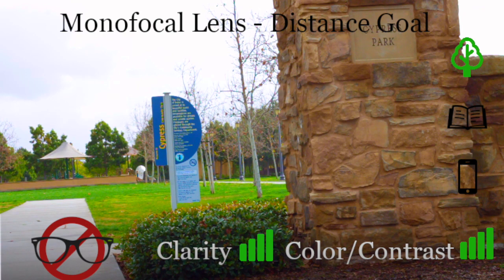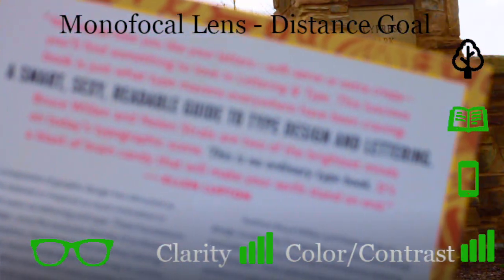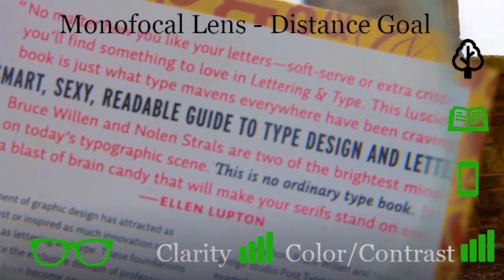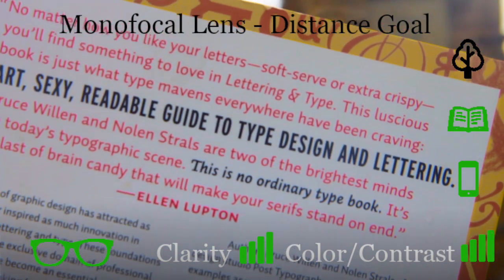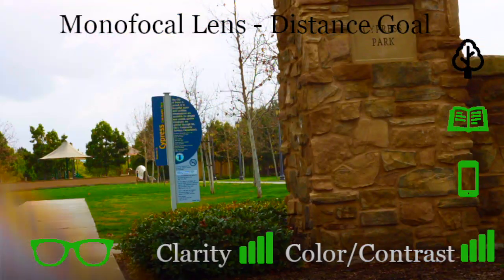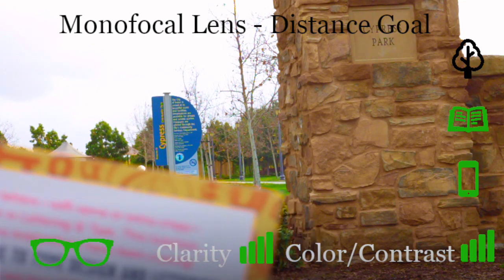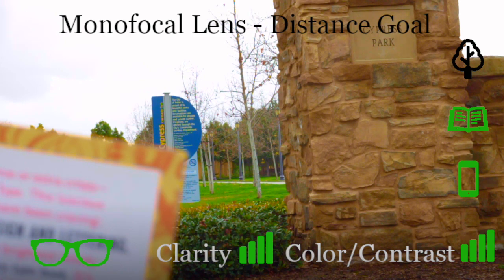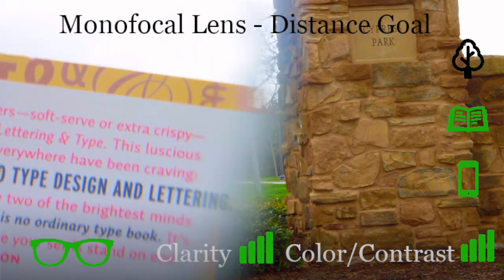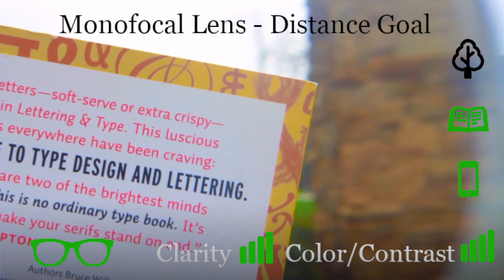And now, just like when you were 45, if a book is brought up close to your face, it will be blurry without glasses. Now we'll put a pair of glasses over your eyes like so, and it'll sharpen everything up. Glasses off, up close will be blurry, the distance will be clear like so. The book's coming back here. It's a little blurry without the glasses. And we'll slide the glasses back on, just like so, and that'll make the book up close really clear.